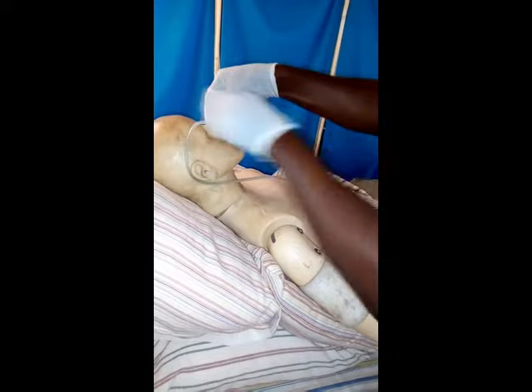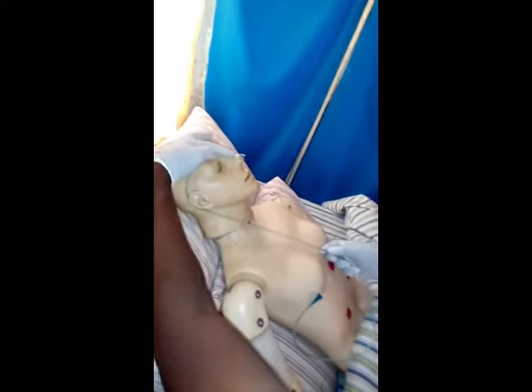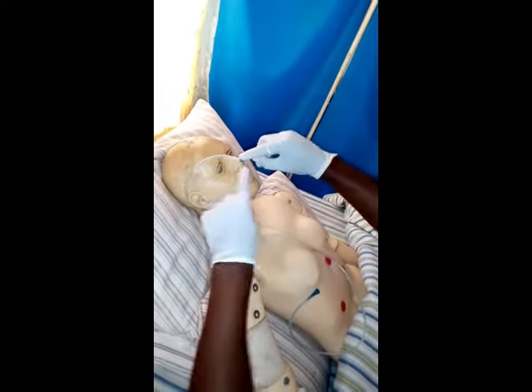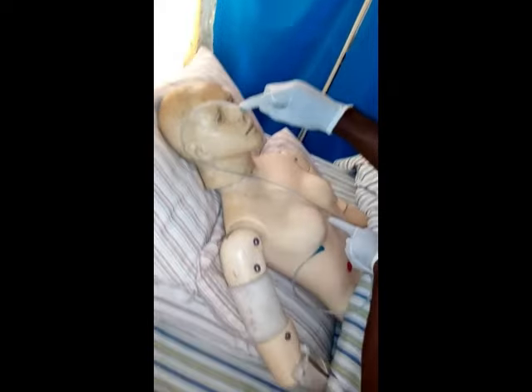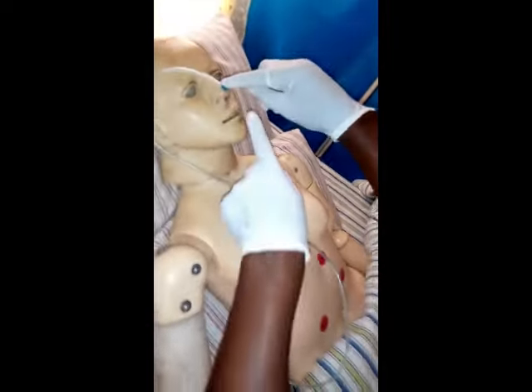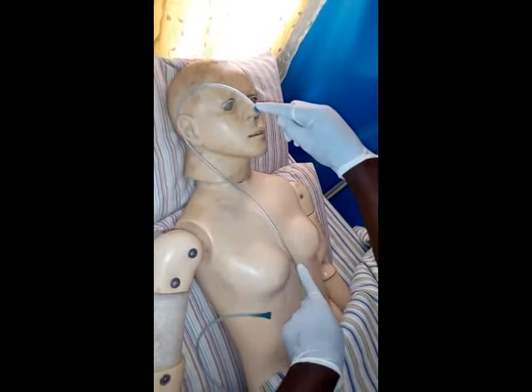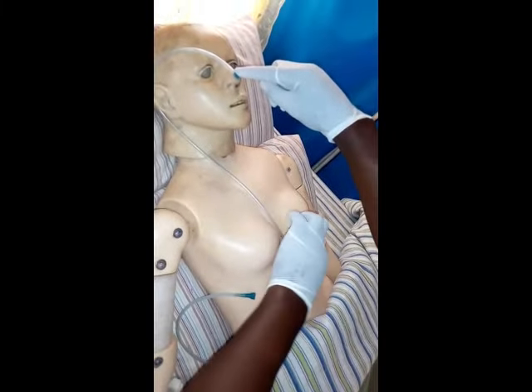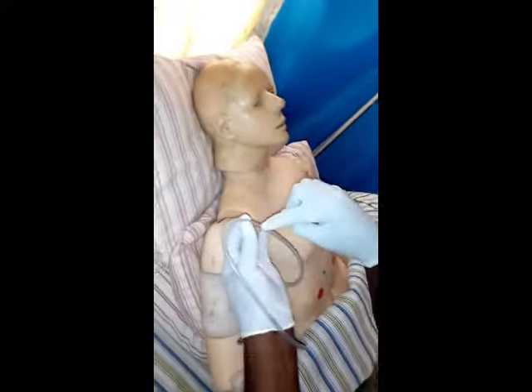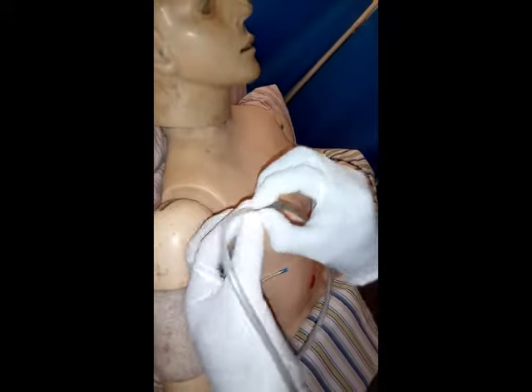Then you have to know your anatomy. If you know your anatomy, meaning from there it goes round up to the xiphoid process. So you have to go tip of the nose, behind the ear, then up to the xiphoid process, which is here. Okay. Now here you can see there's a mark, but here there's no mark. So that's why it's important to get this strap here.